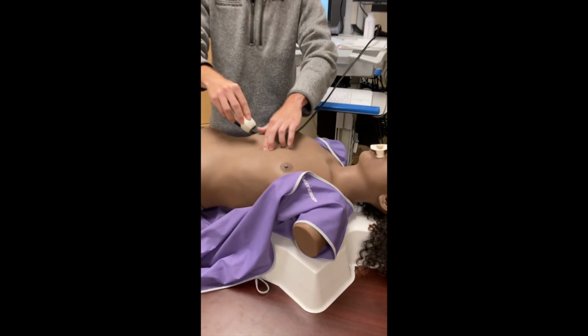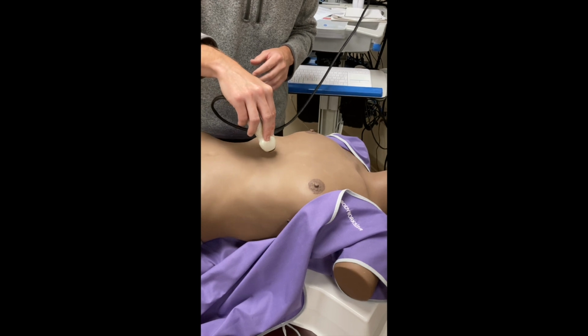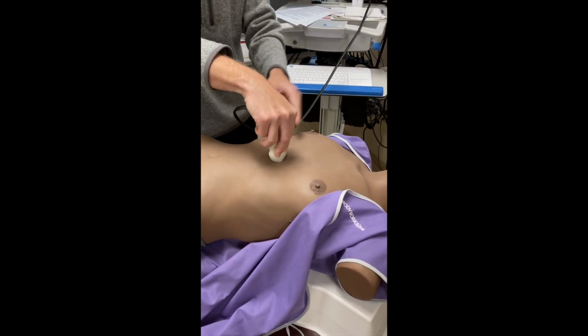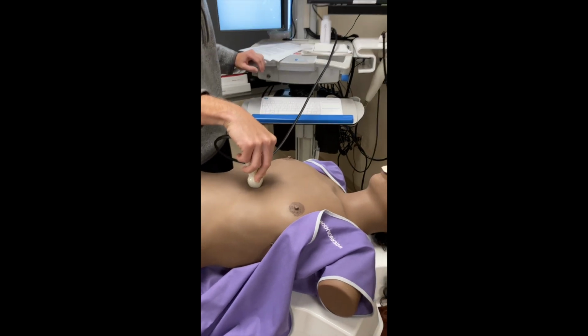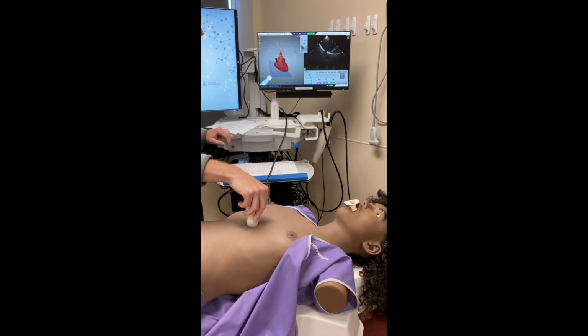Again, you want to go right under the subxiphoid, not on it. It's going to be more comfortable for your patient and allow you to get a better picture. I like to start with the indicator towards the patient's right shoulder. Find your liver first. That's going to be your acoustic window.